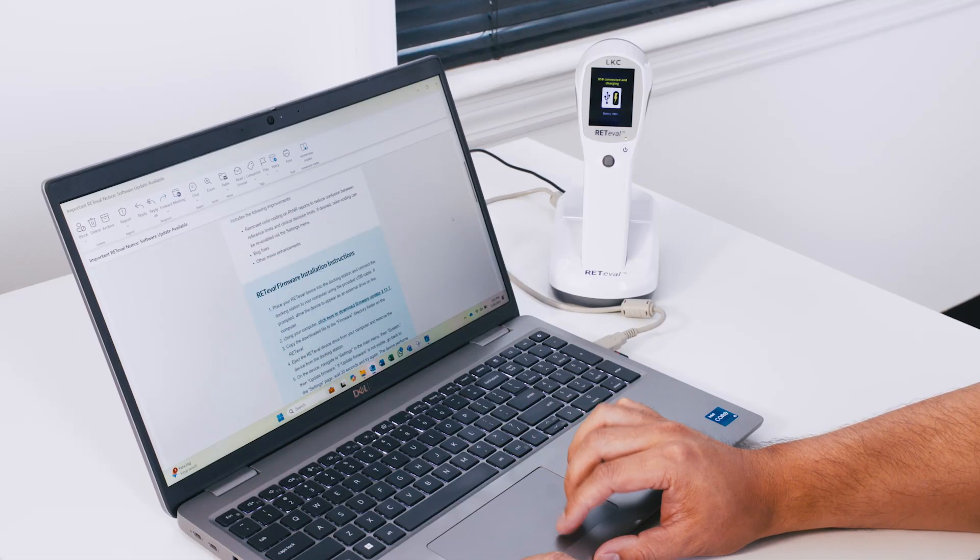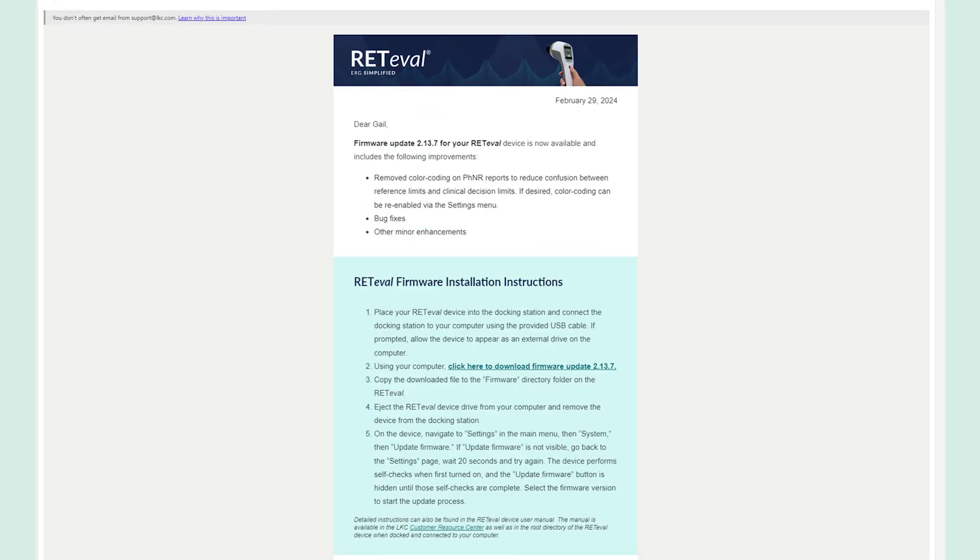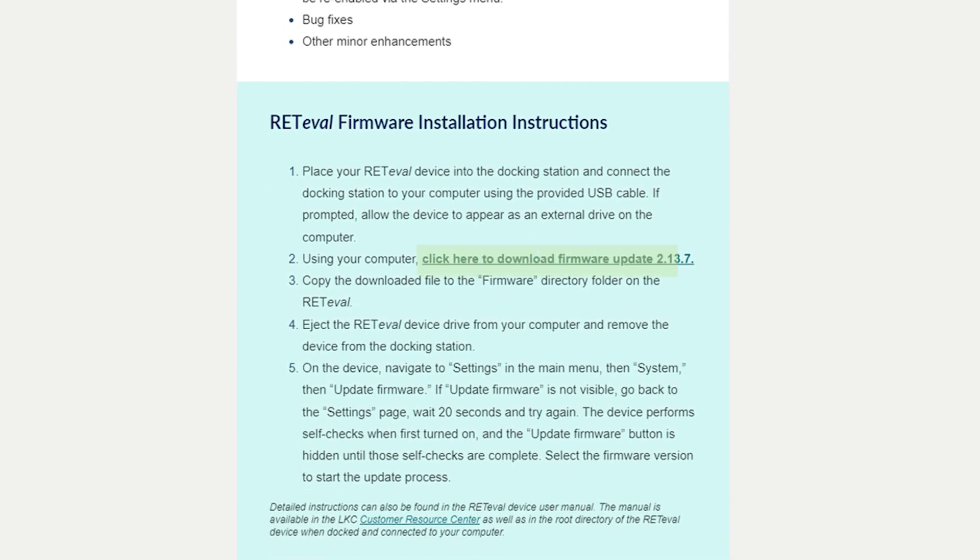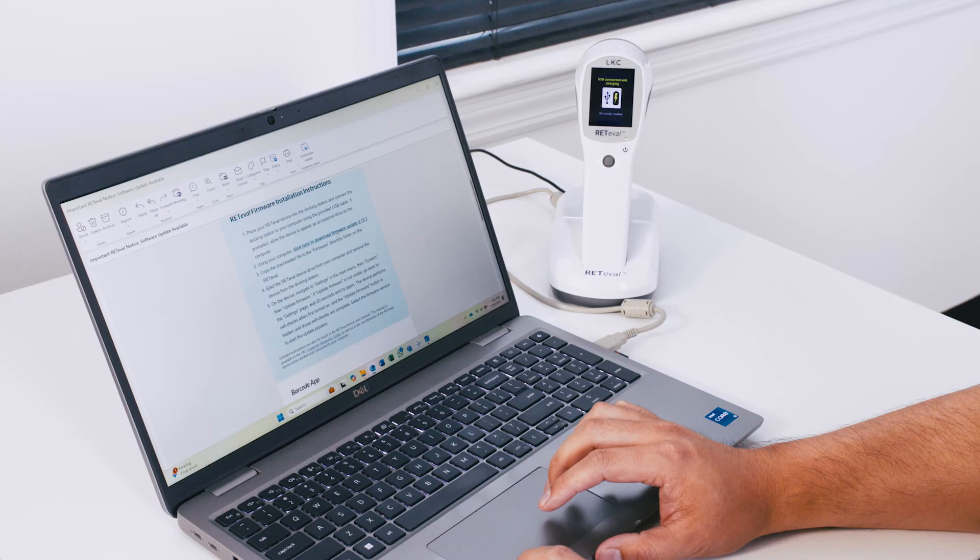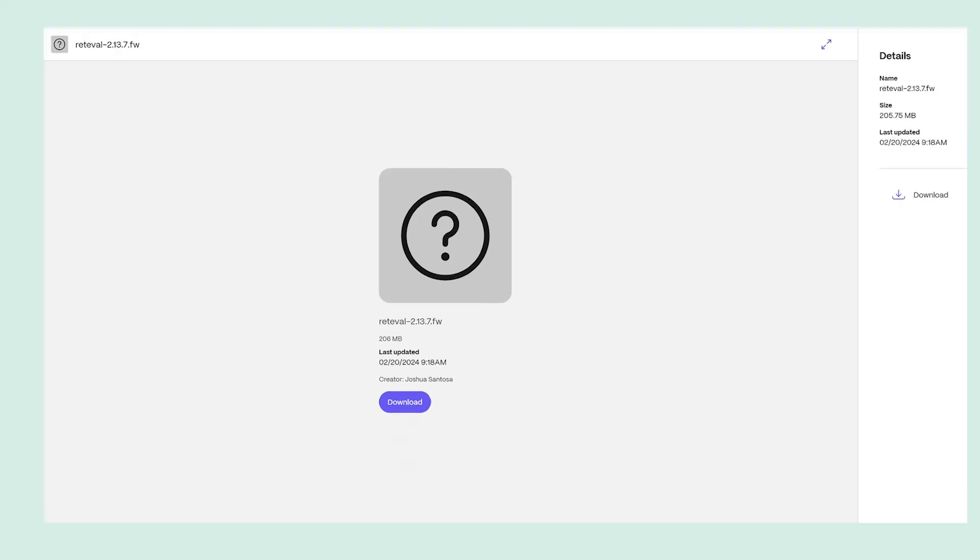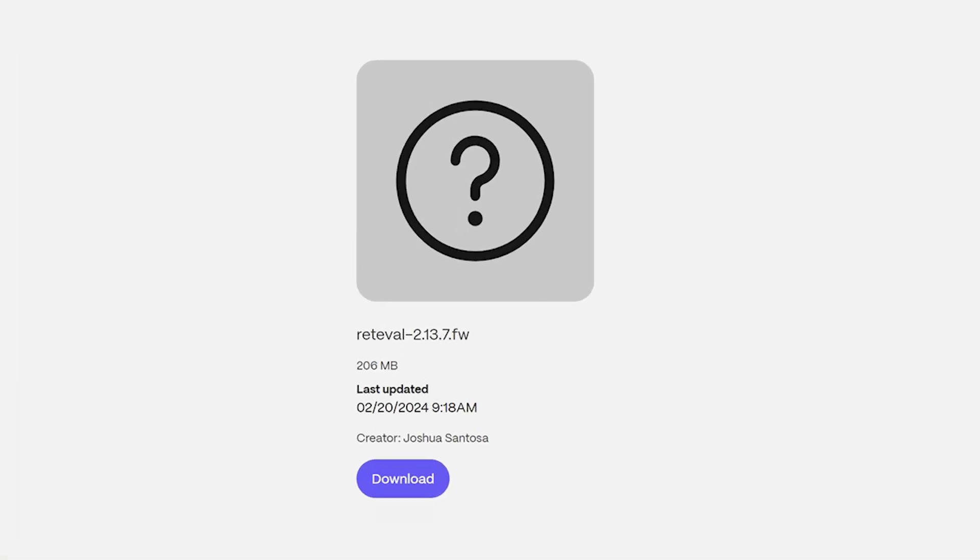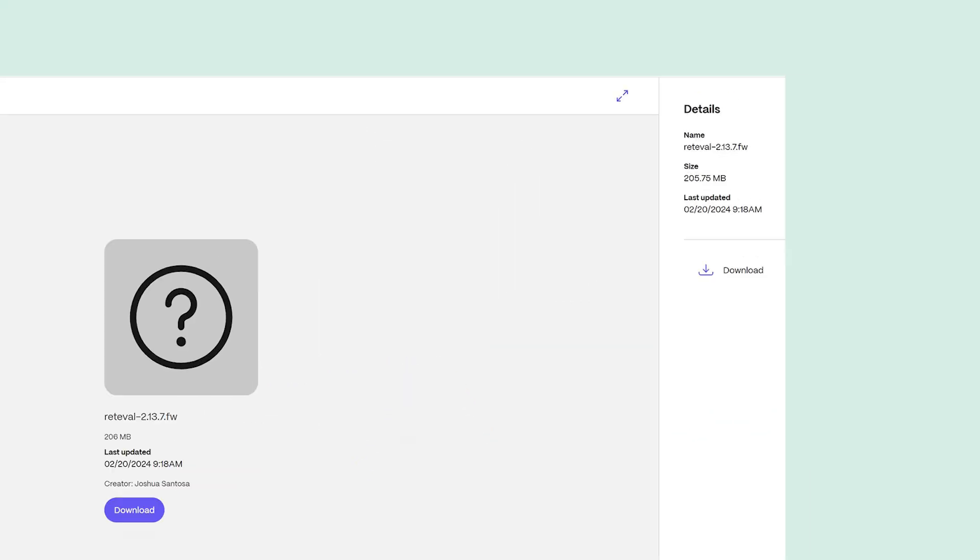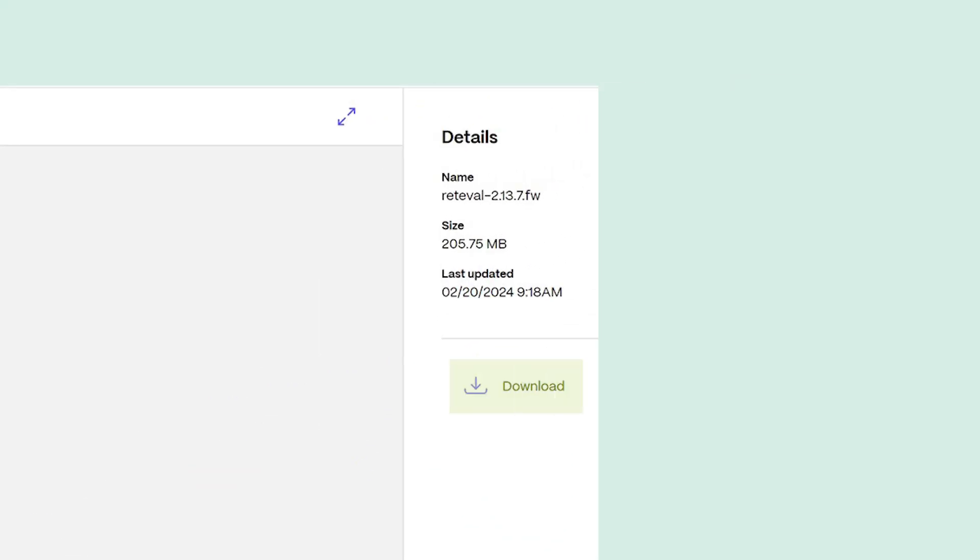In the email you received, click on the link provided for the new firmware update. The link will take you to a page like this on your browser. Click to download the software either by choosing the download button or the download arrow on the right.